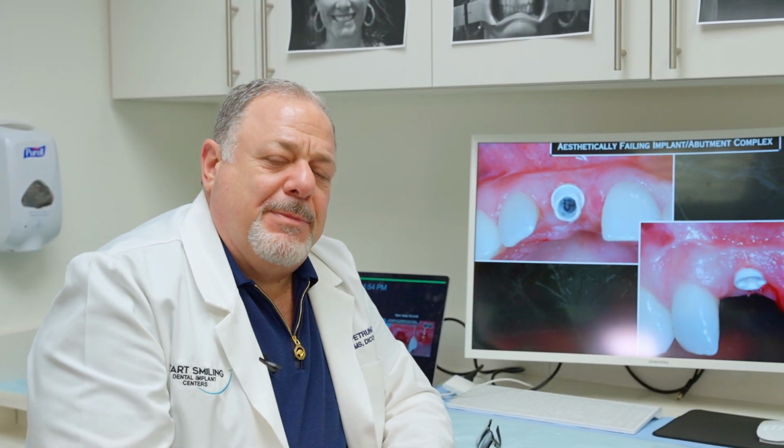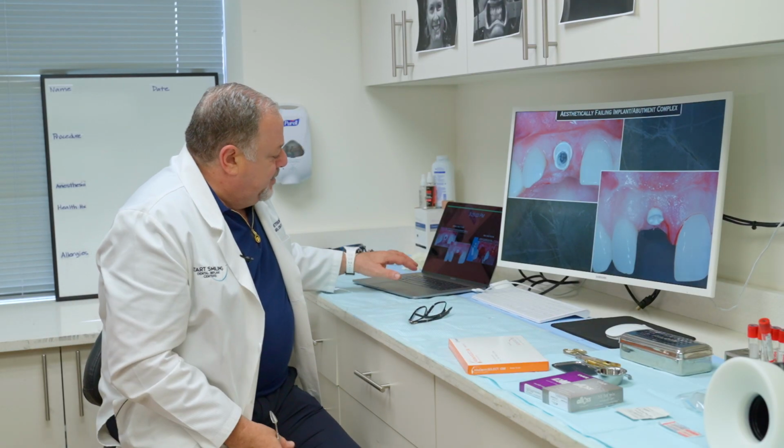This particular implant is made from sintering. You can't really do that, okay? Because it becomes brittle and it would most likely fracture. So that's a negative in this particular situation, just because of the choice of the implant that was put in.